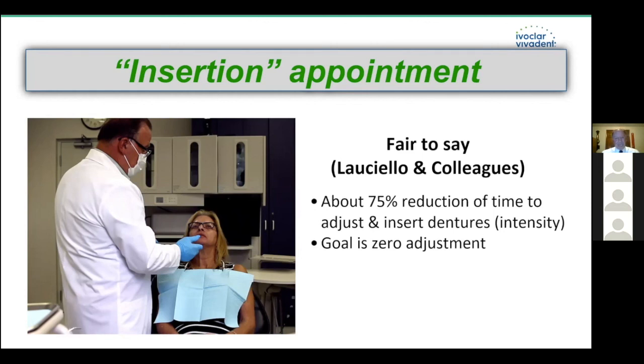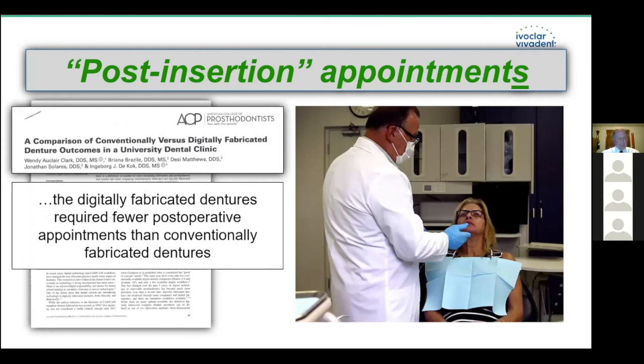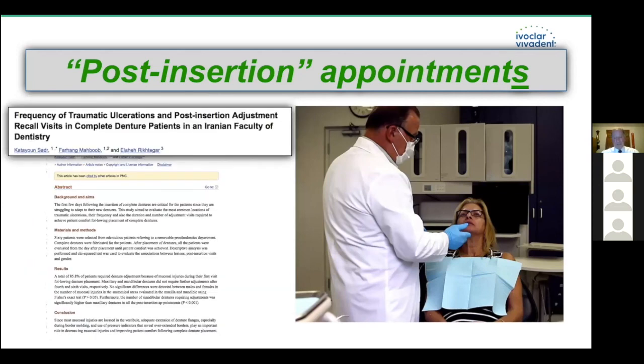And so the intensity of the insertion, in other words the amount of adjustment I've got to do, is very minimal and hopefully nothing. I've never been able to do that in traditional dentistry. Some of the articles written show that this indeed is true, that the insertion with these milled denture bases is going to be less than traditional dentistry.